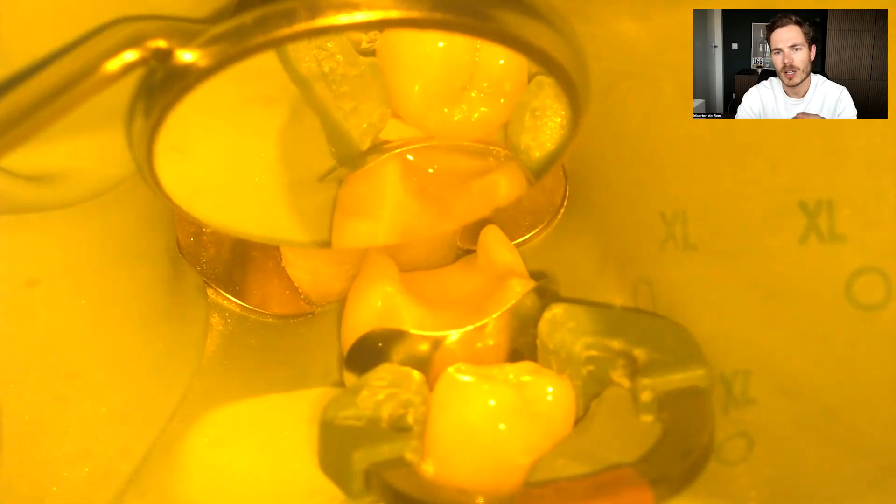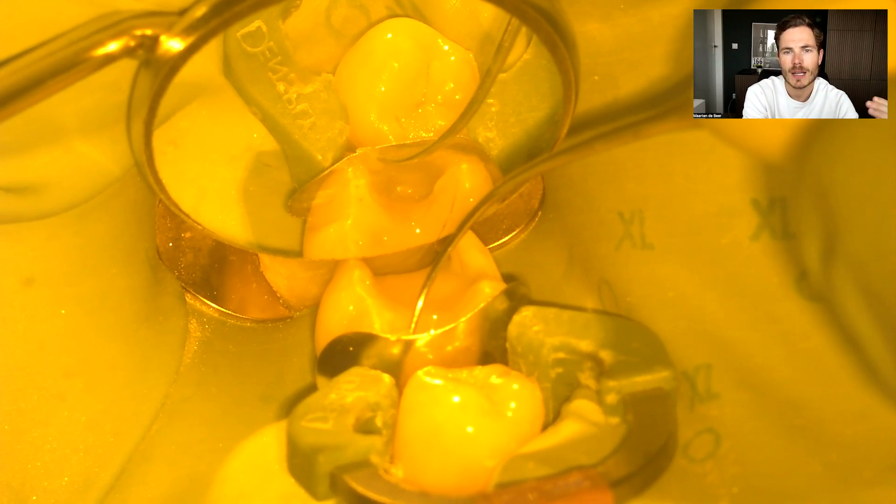I use a really tiny bit of flow as more of a snow plow technique. When I place my composite on top — again the Shofu Beautifil 2 LS in color A2 — it will push all the flow into all the small gaps and crevices to ensure a super smooth transition from tooth to composite. I use my LM Arte Condensa to shape the thickness of the mesial wall, making it approximately as thick as the thinnest part of that instrument. Then I use the LM Arte Fissura with the sharp point at a 45-degree angle to ensure my marginal ridge curves slightly inward. I finish with the brush to make every transition super smooth, then light cure — and the mesial side of the tooth is restored.